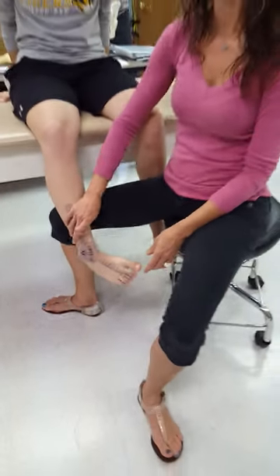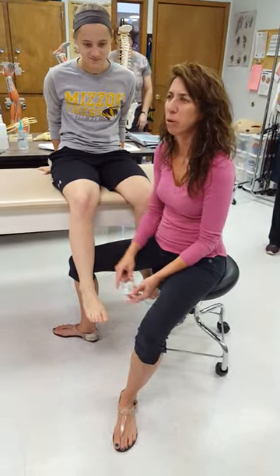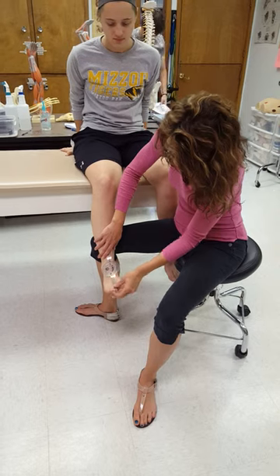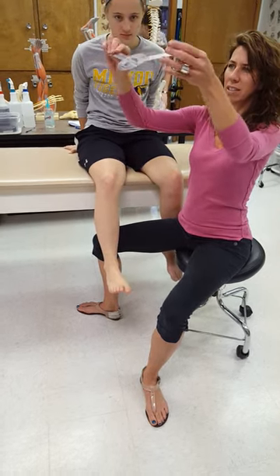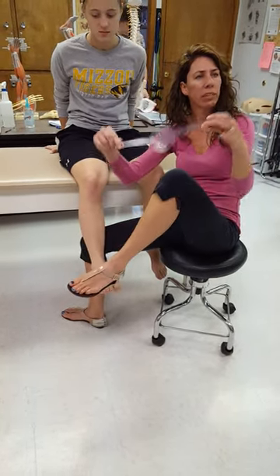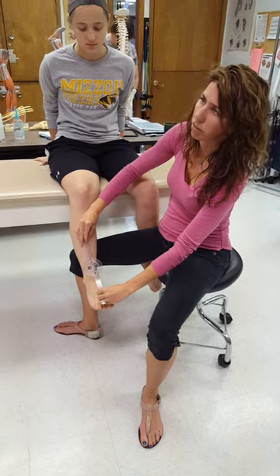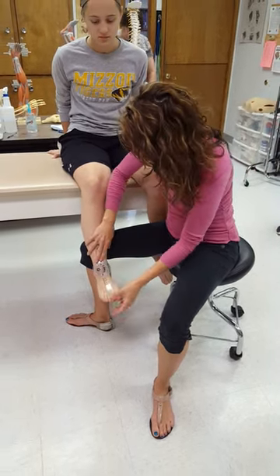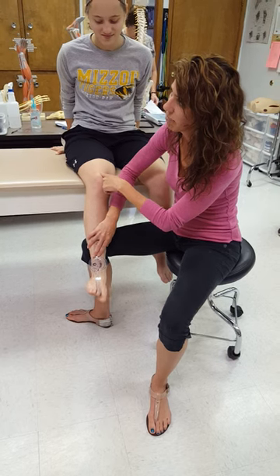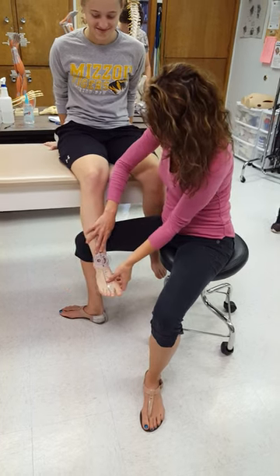The reading here is 40 degrees. Normal inversion is 35 degrees, so she has a little hypermobility. We're going to do the exact same thing for eversion — bring her back to neutral. Notice the goniometer bends, so you can follow the contours of the ankle. Turn the bottom of your foot out to the side — she's doing a little substitution there.